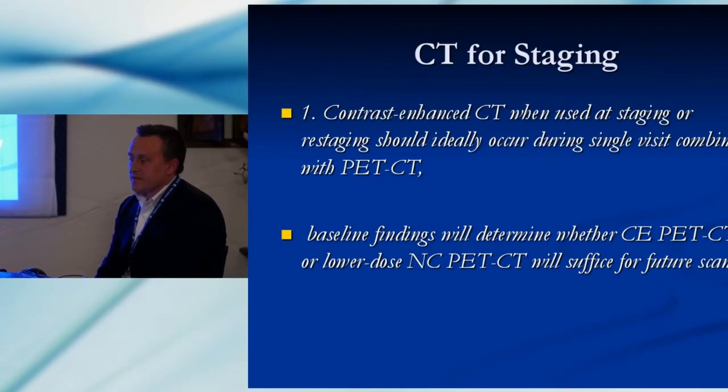The use of CT for staging, contrast-enhanced CT, when used at staging or restaging, should ideally occur at the same time as the PET-CT and preferably as a single visit. The baseline findings on that CT will determine whether or not contrast is useful and whether it should be used in subsequent interim or end-of-treatment PET scans.